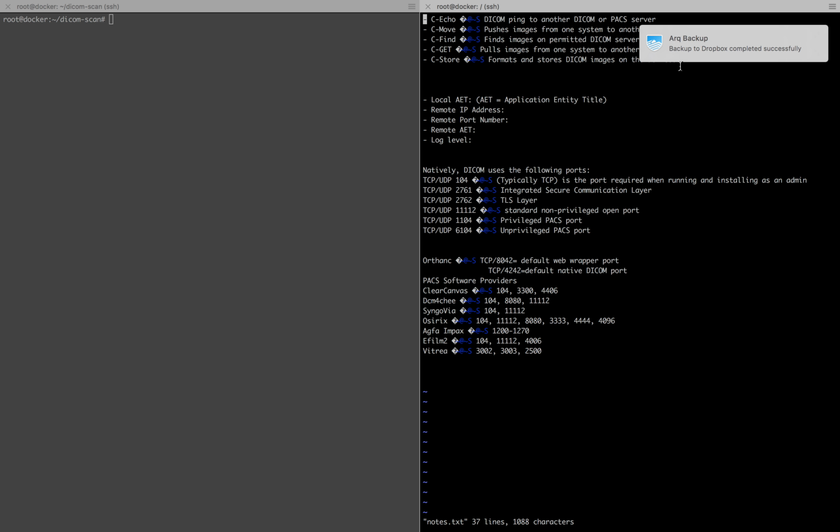But I think one of the reasons why it's not used very much, and I haven't seen it used very much, is because the native protocol has some layers of encapsulation already in it that will kind of protect itself from port scanners like Nmap and Unicornscan and Angry IP Scanner and all those guys. And because of the message you get back from them, it kind of throws them off a bit. They're not really sure what to do with it. So I think that may be one reason why TLS is not used a lot in the native DICOM area, although I think it should be. And then we'll get to some other things about it in just a minute.